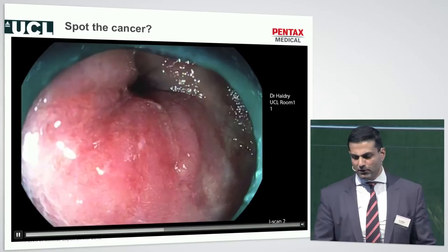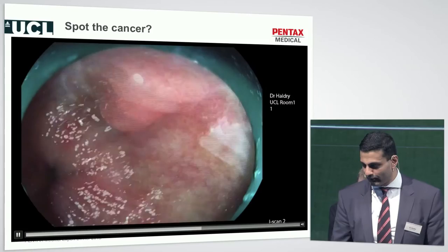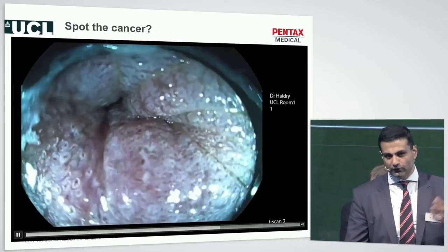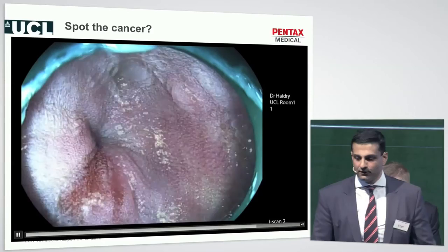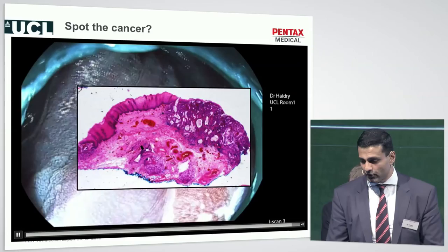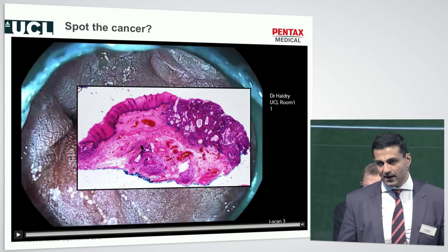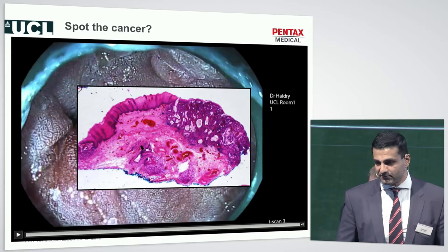So we have guesses of 2 o'clock and 6 o'clock. Now we're going to use some acetic acid — vinegar from the cafeteria — where's the cancer now? Actually, this was resected, and the lesion was indeed at 7 o'clock — an M3 intramucosal cancer. That little lump at the top was just low-grade dysplasia. If you invest time in your imaging and chromoendoscopy and give every chance of a high-quality endoscopy, you won't miss the neoplasia. The resection took five minutes, but it took 25 minutes to find it.